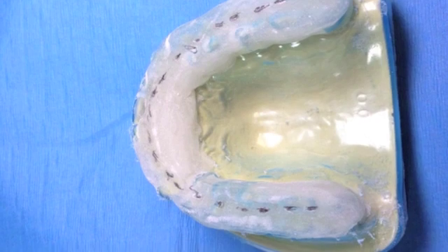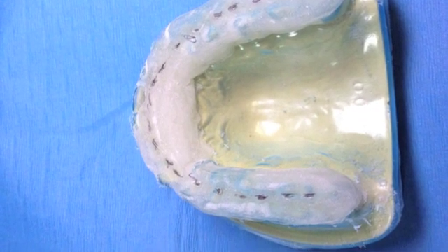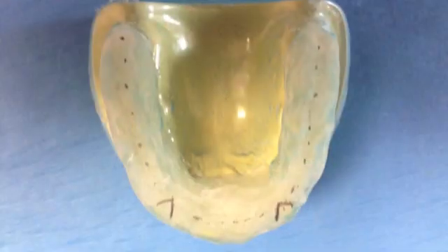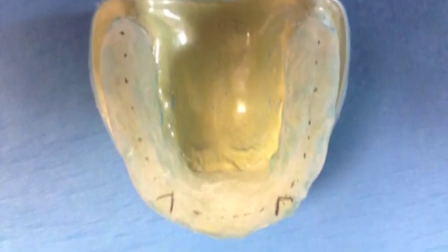After the ortho resin has set, capture the posterior cusp tips in resin as shown in pencil. Adjust away the divots in the acrylic leaving a flat plain area as previously described.